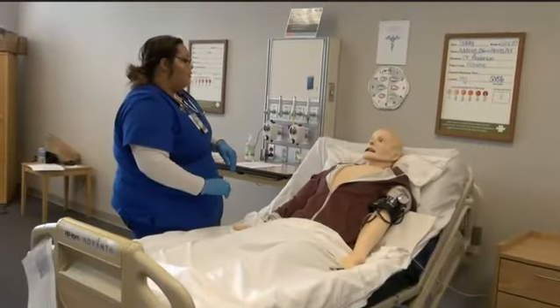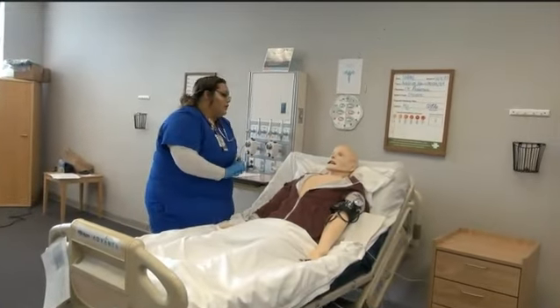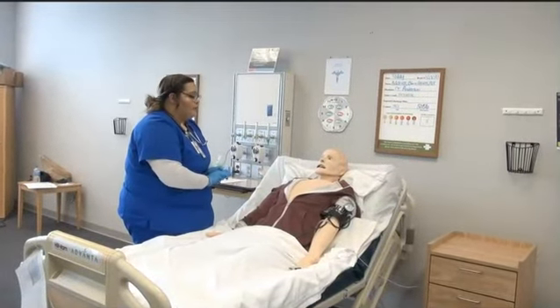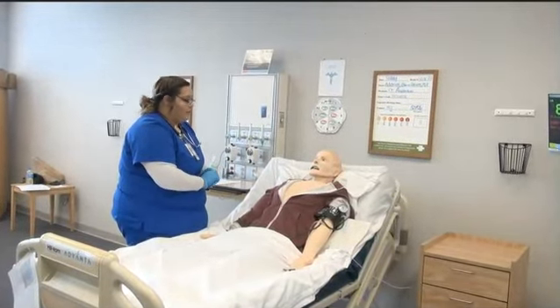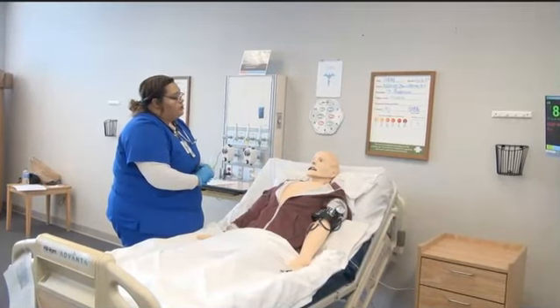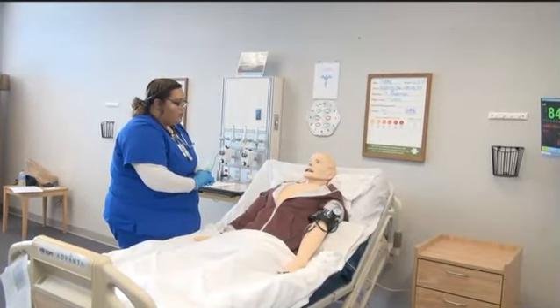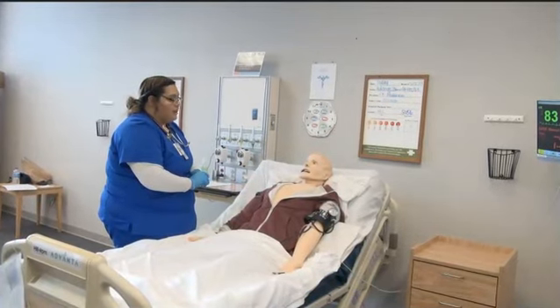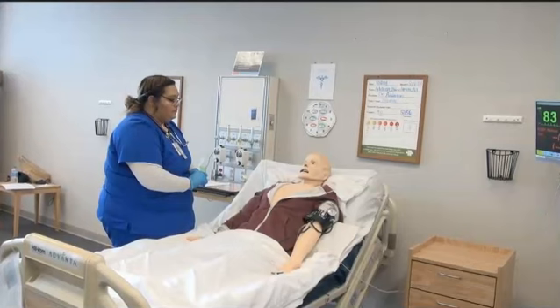Okay, Mr. Sinclair. So what we are going to be doing today is we are going to be doing a small volume nebulizer. I'm going to be giving you a breathing treatment. Do you take any breathing treatments at home? No. Are you on any oxygen at home? No.